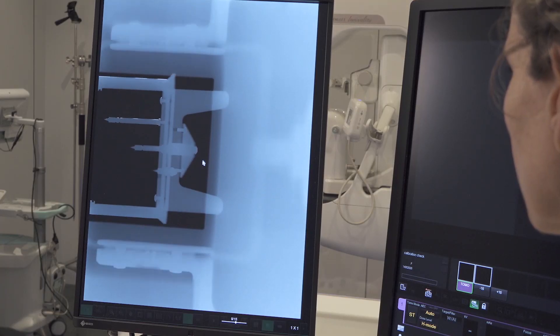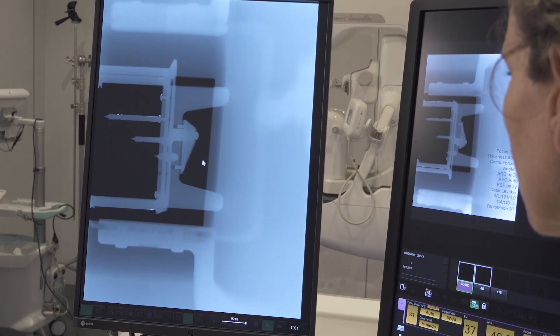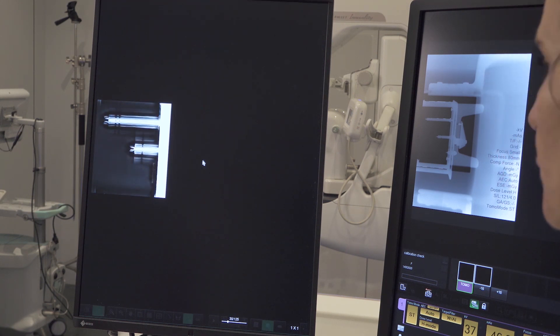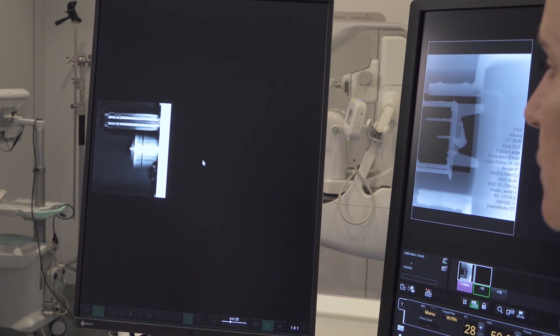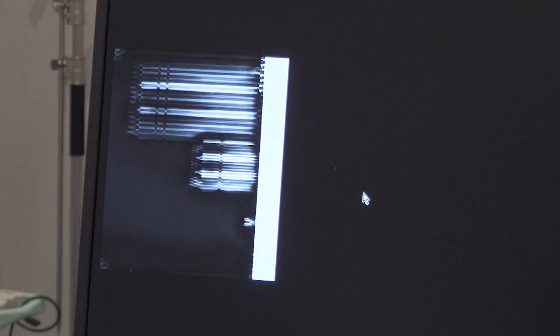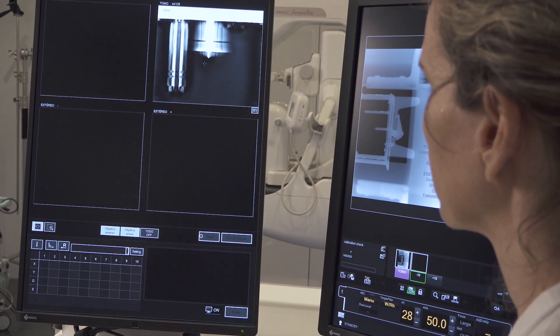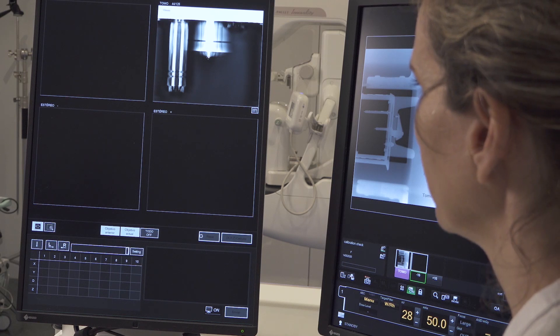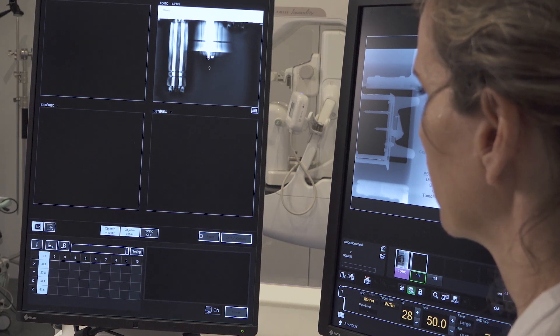Images taken are displayed. Wait for the volume reconstruction. Scroll through the images and select the plane where the selected target tip is well defined. Place the marker on the target.